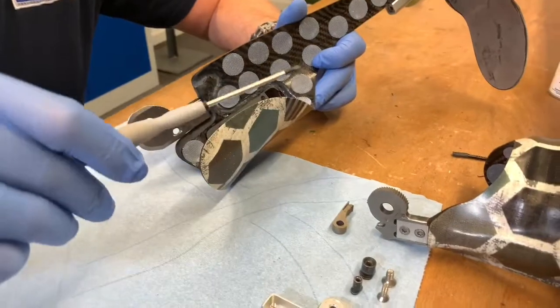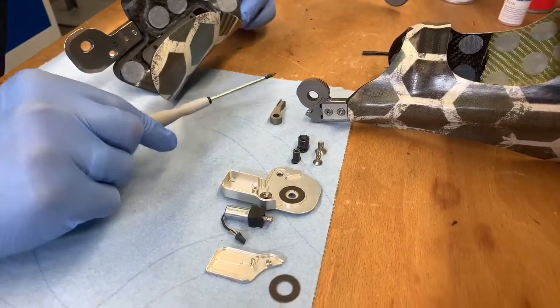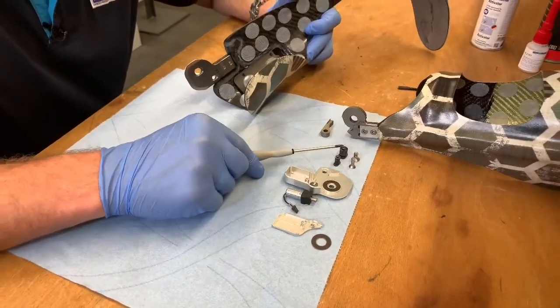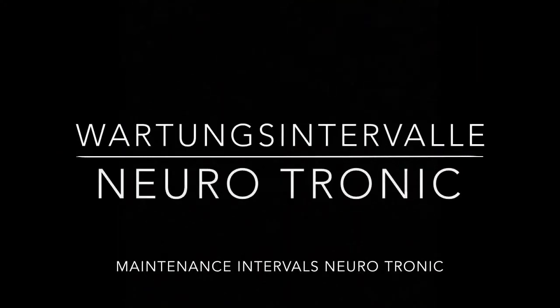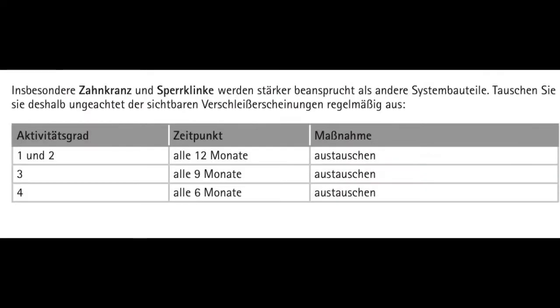Just before we reassemble the joint, we should check all the necessary parts again. All parts should be cleaned thoroughly so that we can see wear and tear clearly. Parts subject to wear and tear are, for example, the teeth of the discs, the bearing nuts and screws, and the sliding washer. We recommend checking the neurotronic knee joint for wear and functionality every three months. The tooth disc and the pawl are subject to more stress than other components and should be replaced on a regular basis regardless of visible signs of wear.